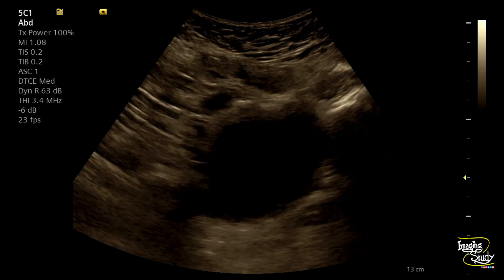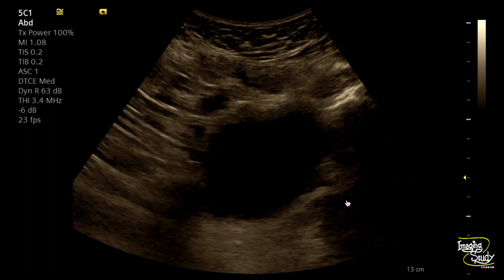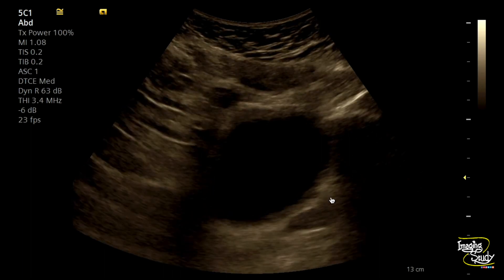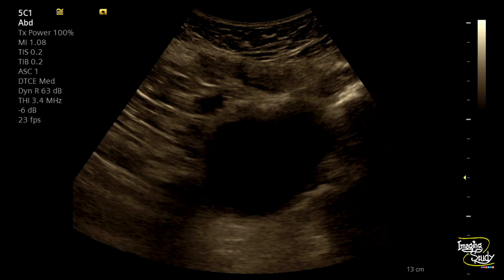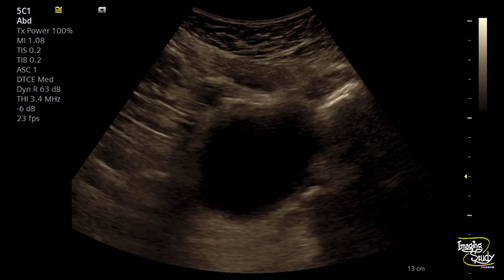On longitudinal section, you can see the prostate and the prostatic urethral area, with the hyperechogenic structure impacted at the proximal prostatic urethra. On both transverse and longitudinal sections, the hyperechogenic stone is confirmed to be impacted at the prostatic urethra.